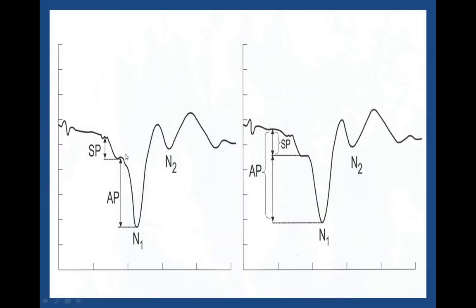The term whole nerve versus compound action potential tends to be misused, I think, sometimes in the literature. A whole nerve action potential basically leads one to believe the entire nerve is responding because it's a very broadband signal. In reality, the signal isn't all that broadband. It cuts off due to the filtering characteristics of the transducer, outer and middle ear, so you're getting a contribution from a relatively narrower portion of the basilar membrane than the entire membrane. So whole nerve is really kind of a misnomer.